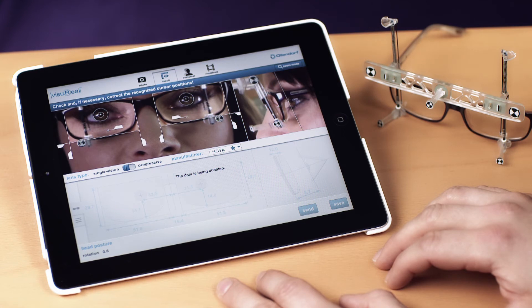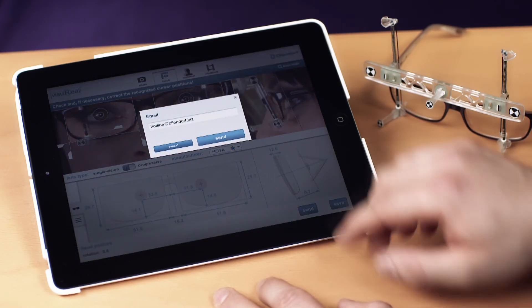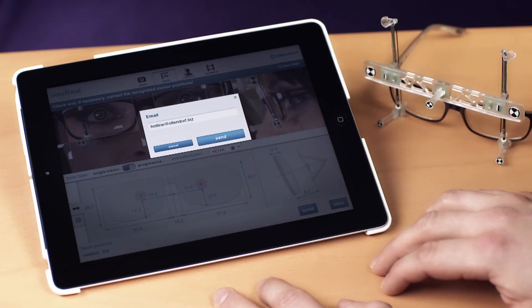Then upload the applied corrections. The recalculated results will be displayed by return. Email the results to your own mail account in your store. This completes the measurement procedure.